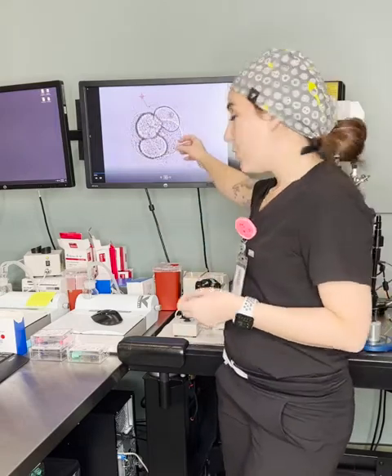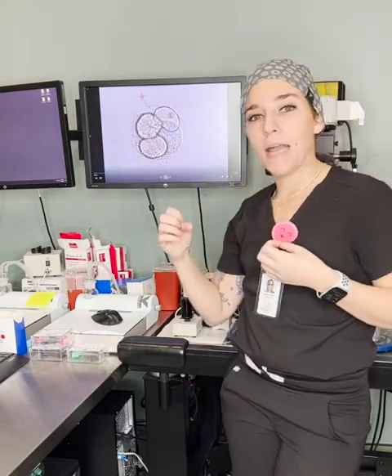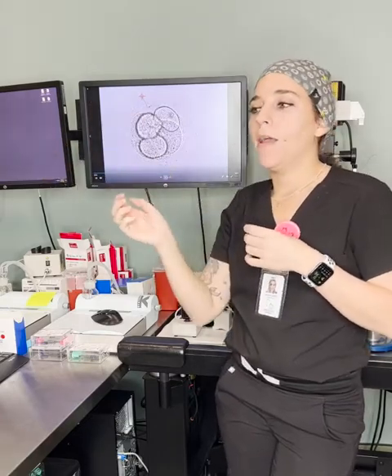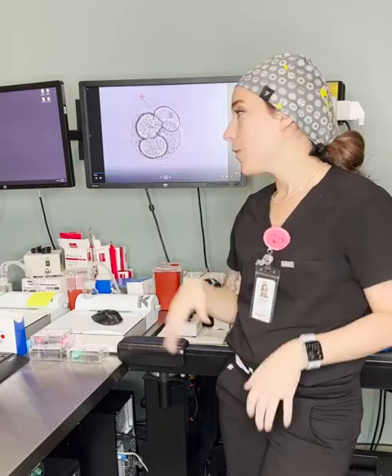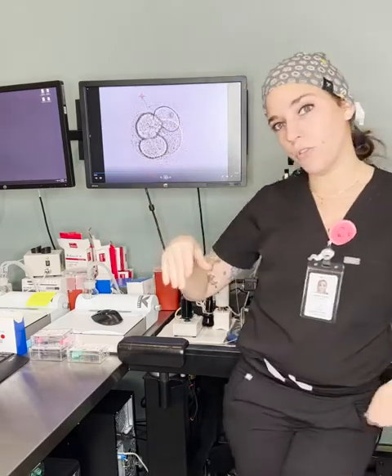So what we do is we just pull off cells off the blast, cut it with a laser, take those cells into a separate drop, let that embryo collapse, and then we freeze it, and then we take those cells, put them in a very tiny tube, and send them off for testing. We freeze the embryo and keep it on site. So this is kind of a precursor to that.